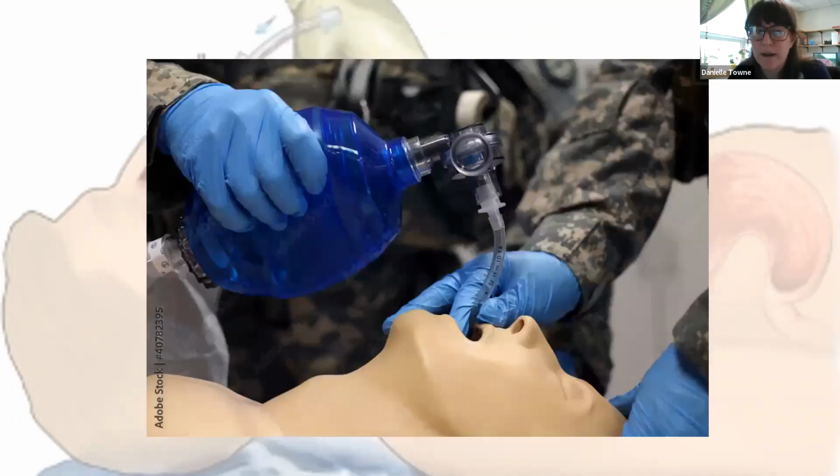Then we're going to talk about a couple of other techniques that we use that will help to confirm and support that. We would look for chest rise and misting in the ET tube while you're ventilating. Seeing chest rise tells you that air is going into the chest, right? And misting infers that air is being exhaled. Do realize that in kids and small adults, it can be hard to differentiate chest rise and abdominal rise due to their body habitus. And misting can also happen if there's a lot of air in the stomach. So that's why this is an important step to look at, but it's not the gold standard.